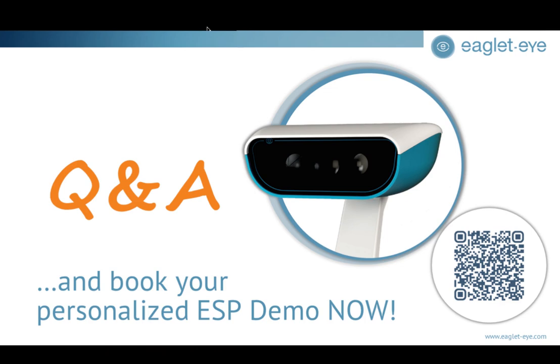I think that also softens things just a little bit so that our lubricating drop stays on the eye. And to be honest, there are not very many patients that we can't get good data on. Now, when we analyze data, you do have to be cognizant of that. And that's not just with dry eye patients, and not just with the ESP, but with other units that measure anterior eye shape, which can also have defects because the tear film breaks up. That's where it's really important to go back and look at the quality of what you're taking, and if the indices show that you're getting a lot of tear breakup or we're not getting enough coverage, you just have to go back and take another image.